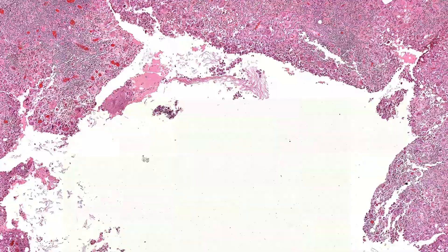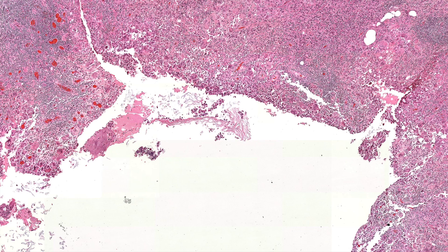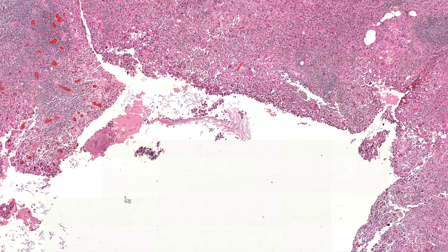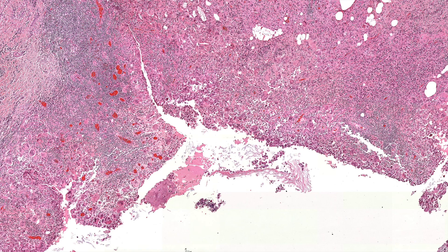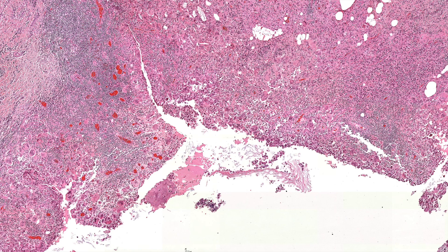Here it's just a ruptured epidermal inclusion cyst, also known as epidermoid cyst or follicular infundibular cyst. How do I know? I can't see the lining, but that loose flaky keratin pattern is the kind that this type of cyst produces. Am I 100% sure? No, but it's probably a follicular infundibular or epidermoid cyst based on the keratin flakes.